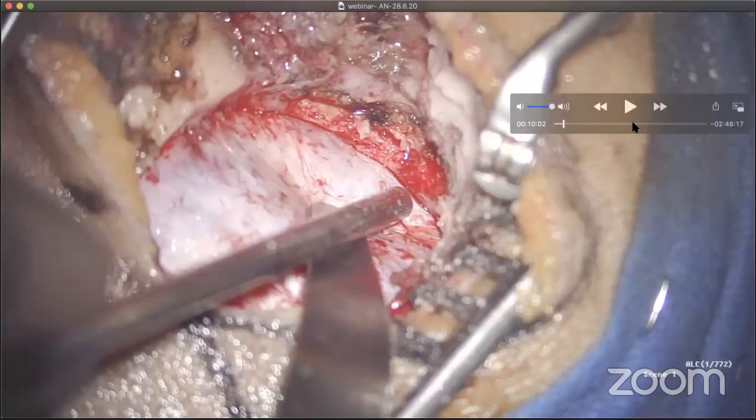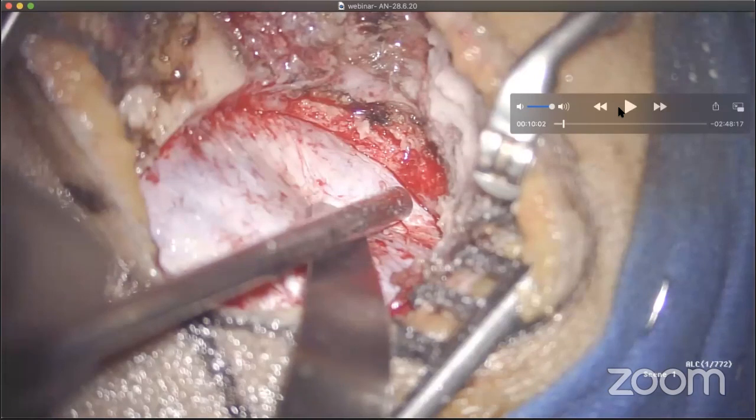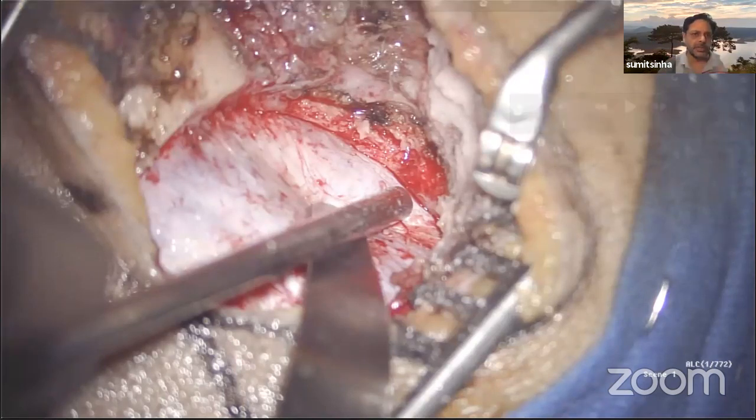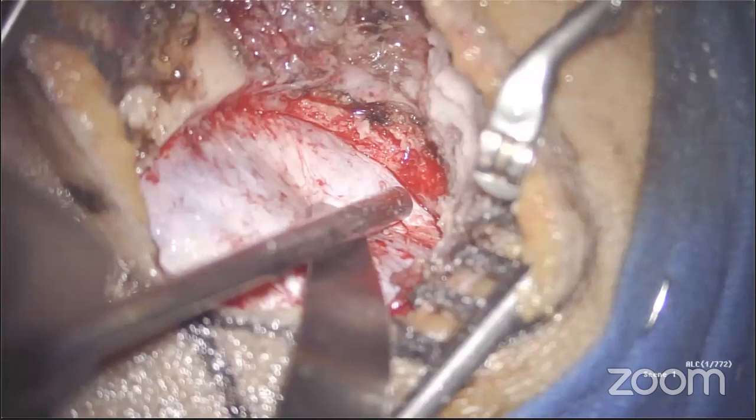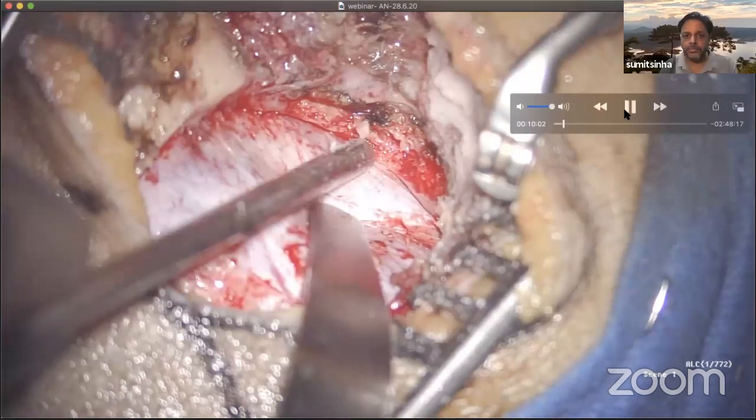When you use the instruments in the tumor, don't you have problems with the retractors laterally? Do you have a good angle using those retractors in that small incision? Oh yeah, you see there are two laminectomy retractors, self-retaining retractors. They are applied one at the lower end of the incision and one at the upper end, and they keep retracting during the entire surgery. Okay, thanks. So, proceeding forward.